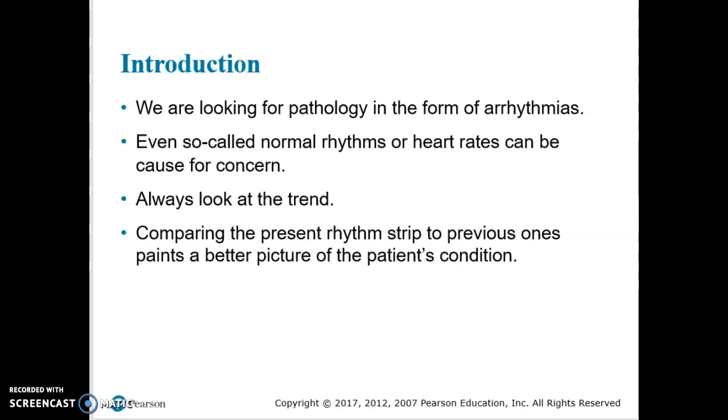So we're learning how to interpret what we're looking at so we can watch for trends. When we watch for trends, we're going to compare the present rhythm strip to the ones that we have previously taken in the past. I'll give you an example of what we mean by trends.